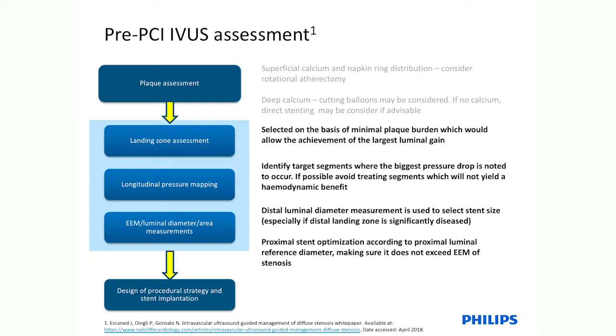Remember that if you stretch the coronary segment aggressively, you immediately trigger a vascular repair reaction that will generate neointimal stenosis. So typically we try to identify a segment that is devoid as much as possible of atherosclerotic plaque, with a stent size that allows apposition at this point.